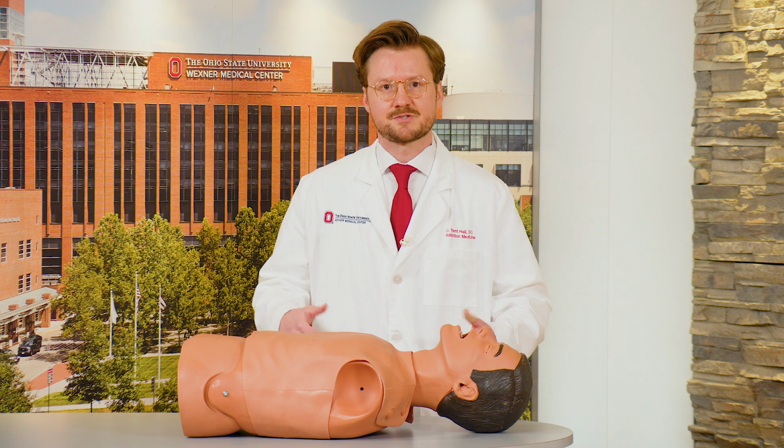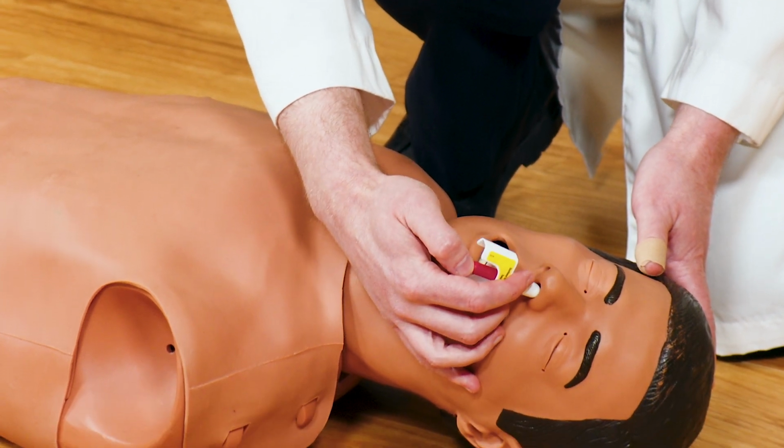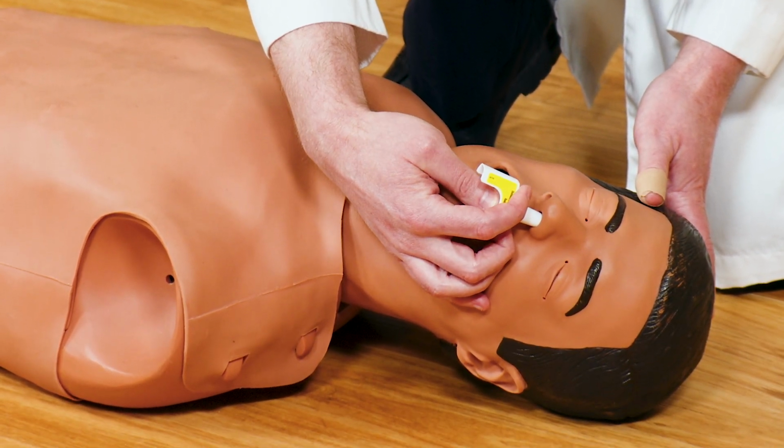Accidental opioid overdose is happening in communities across America. And so it's possible that you might be out in the community and see someone who is unconscious, who doesn't appear to be breathing. If that's the case, then you can use your Narcan kit to try and save their life. This is a medication that if they are unconscious for some other reason, it won't harm them to give the medicine. But if they are having an opioid overdose, you can save a life.